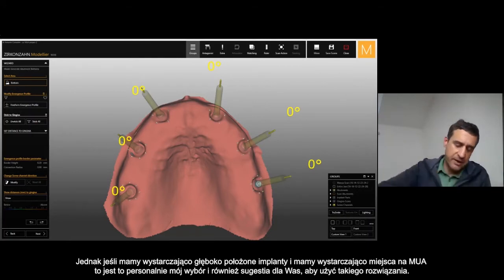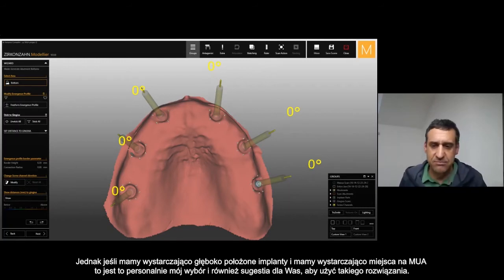But if we have a really deep implant and we have enough room for the MUA — for the multi-unit — that is my preferred choice: to use a multi-unit abutment in between the implant and the framework on top.